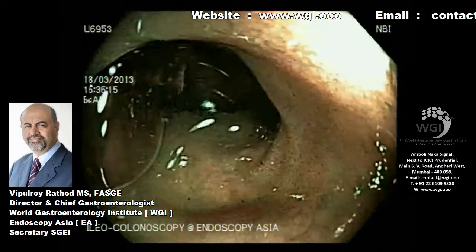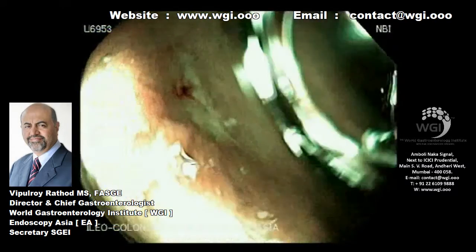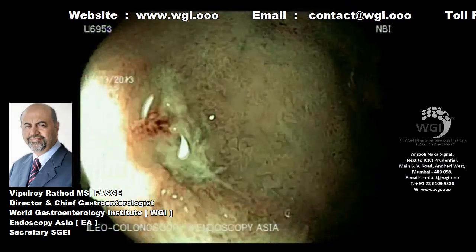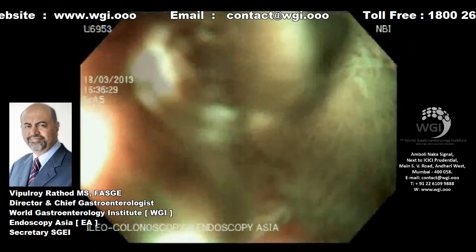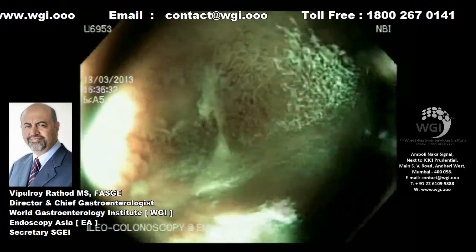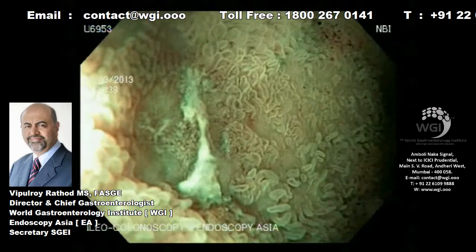As we come back, we can see a small ulcer in the proximal ileum with some bleeding at the base of the ulcer. On closer look, after washing the ulcer, the bleeding reappears very nicely and you can see a small spot of blood.